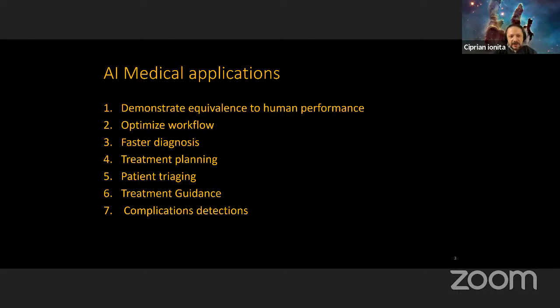So the AI medical applications, as we said, at least in endovascular procedures, we start first with simple things to help triage patients and to help with stroke diagnosis, especially in areas where there are a lot of patients or a lot of cases. And this in general is just for early identification of those patients that are at immediate risk and to prioritize them.